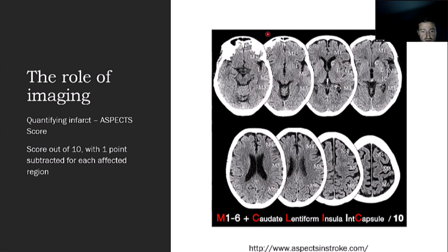Yeah, Derek, go ahead. Sorry, my screen froze. Ian, just 2 questions. I often find it really confusing when the patient already has a lot of ischemic change or a prior infarct. Are we to include those areas of ischemia in the aspect score, which is not necessarily acute? Because how does that help? Or are we to exclude them?